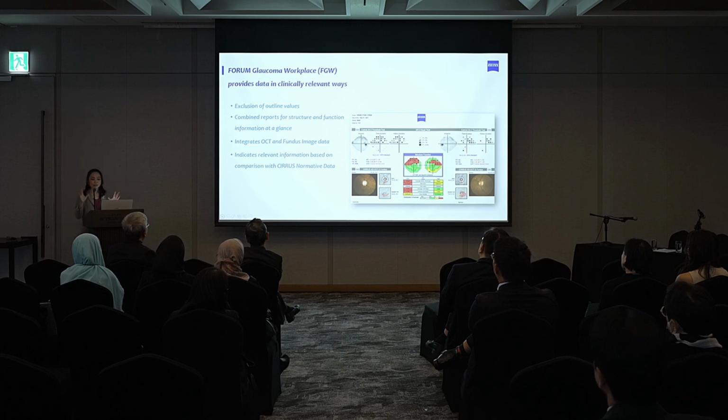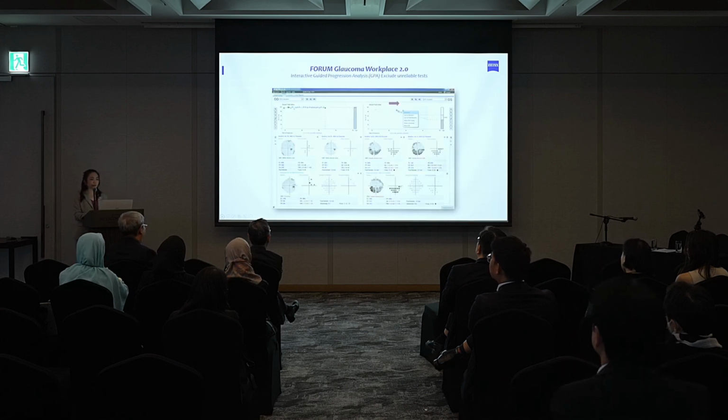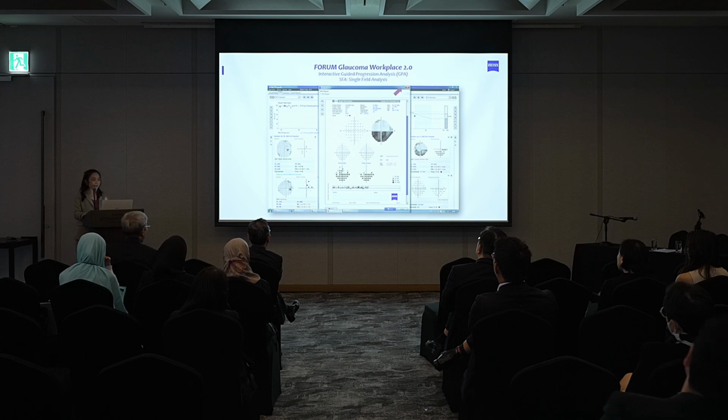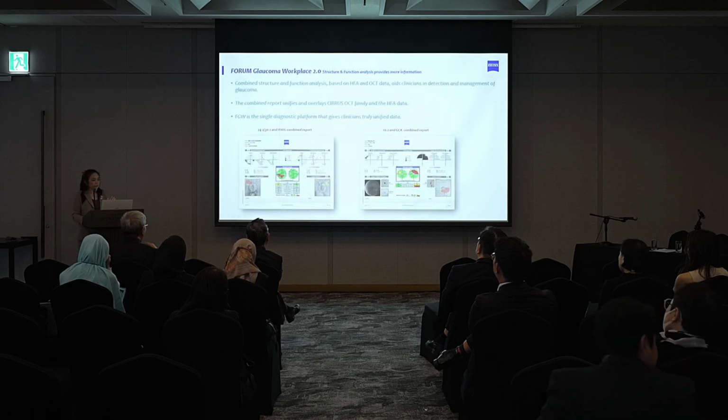All right, and you can also check whether it's a mimic of non-glaucoma. So you can compare with the OCT, fundus photograph, the visual field, the RNFL defect. Is it related? Is it really glaucoma? So it's a lot easier for you. You can deselect them. You can zoom them in one piece to see how it was on that day. So there is a lot of saving.